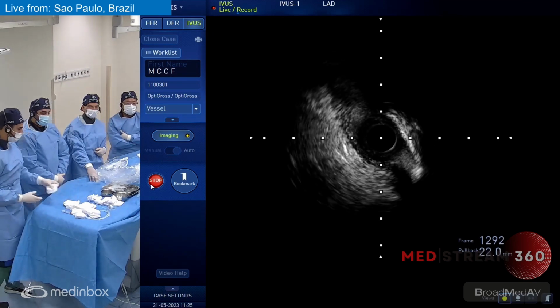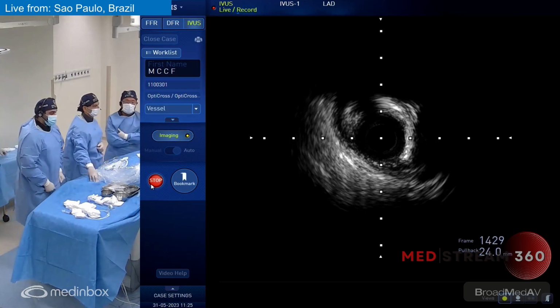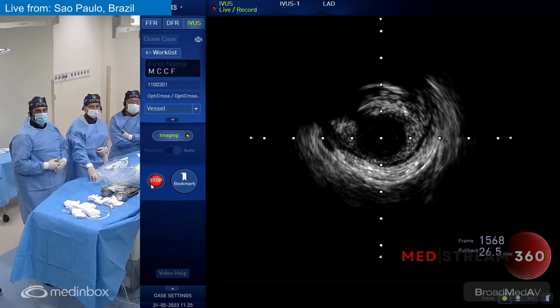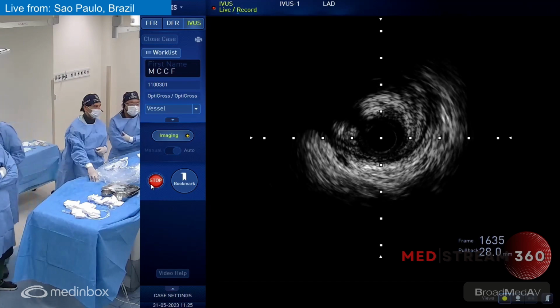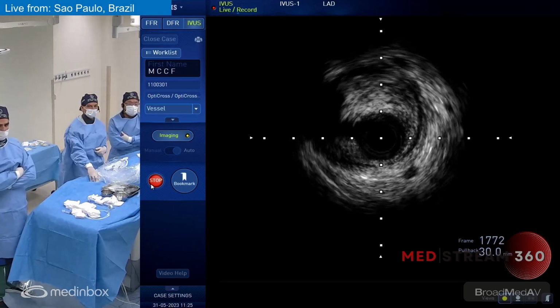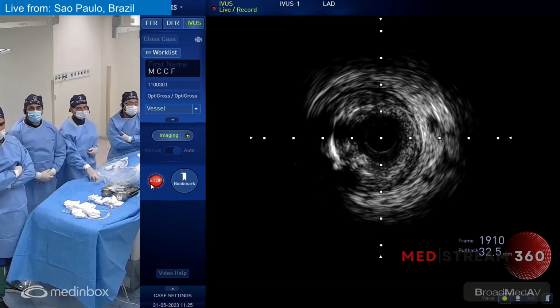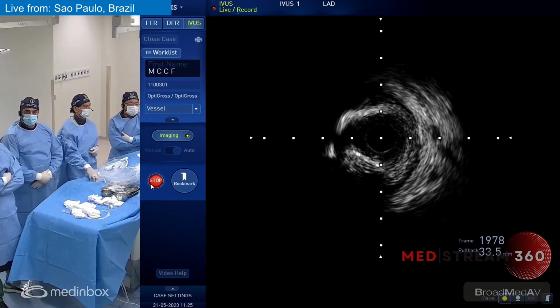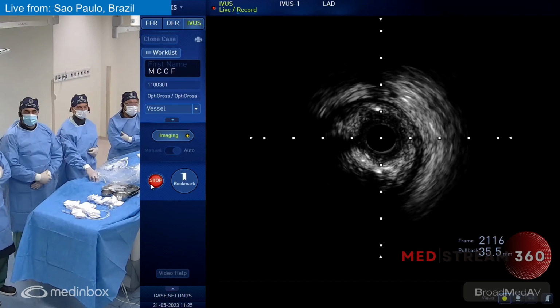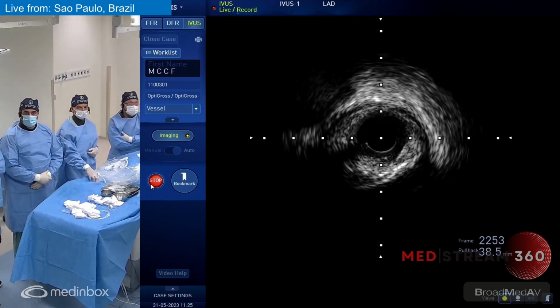We are here in the proximal segment, and there's calcification throughout the entire segment. Plaque burden is really large, as one would expect. I see some micro dissections here due to the balloon angioplasty. We see a much larger vessel here, close to 4.0, with a large plaque burden. Here's some dissection at 9 o'clock. Definitely this lesion will need some good lesion preparation.